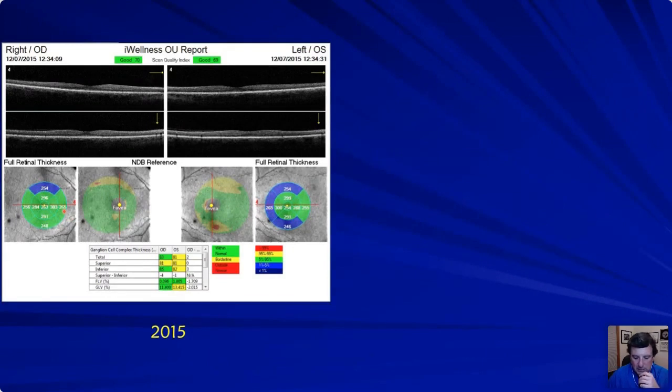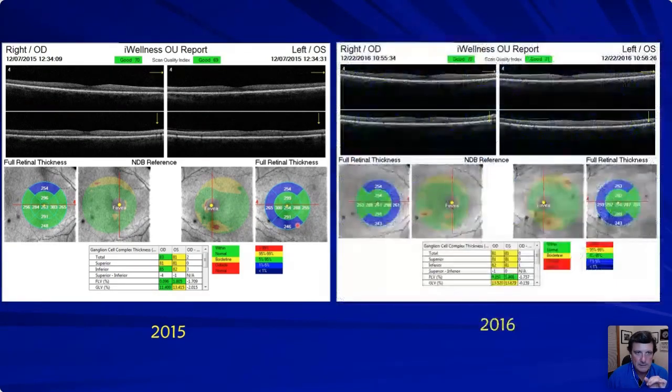I've discussed this with the programmers, and there's more than just that number. It's a whole volume set. So this one gets triggered as being normal, and this one gets triggered as being abnormal, and it's the same number. And then you drop down here, 2 microns makes a difference because 246 makes it blue. So very symmetric. I would not be too concerned with disease.